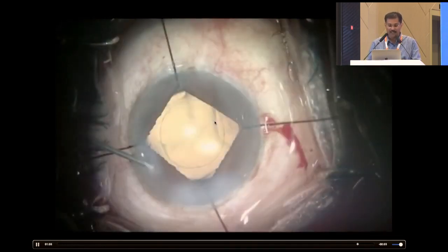This was the original one, this was the expanded one. But then I don't think it gives you any advantage for doing a small one, and then only for maybe a patient satisfaction part, if the patient is insisting on a laser, and some people are really happy if laser is done on them. I could do a rhexis, so I was so happy that it is the mindset of people. So why not make them happy and do your job well?